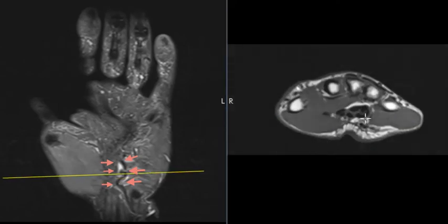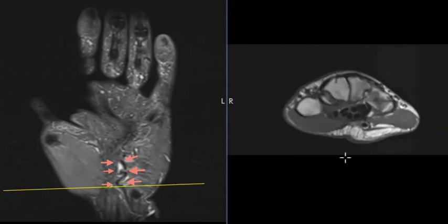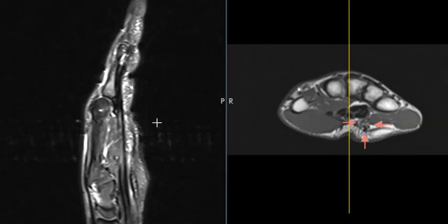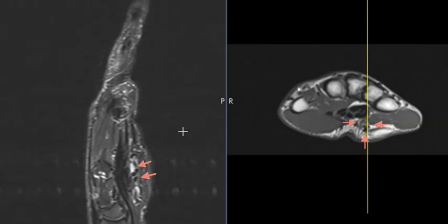Now we can see this on another view here - this little tangle of blood vessels right here is where it has that corkscrew. I'll put up one more view from the side, a sagittal view. In the sagittal view we see one, two, three dots - these are just the same blood vessel with a corkscrew appearance. That's it, a case of possible hypothenar hammer syndrome.